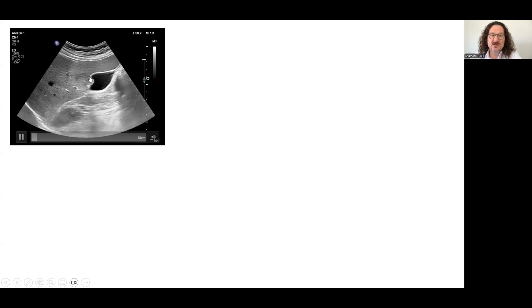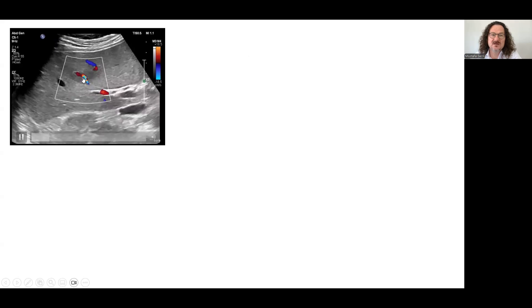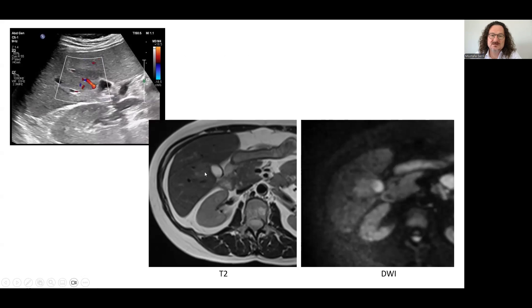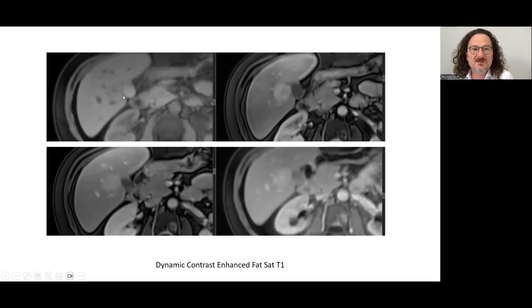This is an example of FNH: a slightly hypoechoic lesion with a central feeder artery. On MRI, it is very slightly hyperintense on T2 with very mild diffusion restriction. The enhancement pattern shows an isointense lesion with a hypointense central scar, followed by early arterial enhancement and persistent enhancement during all phases with no washout. The scar enhances in the late phase.